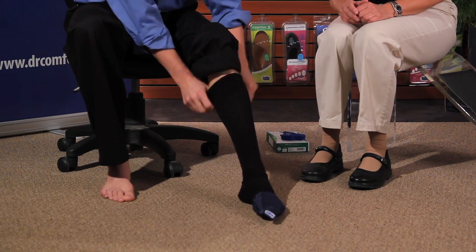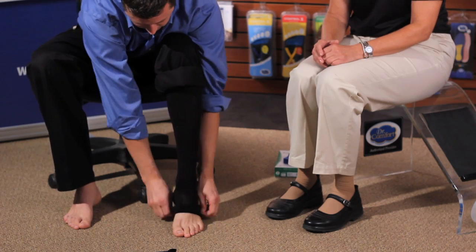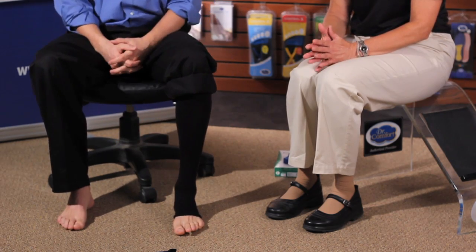It may need a little readjusting — that's normal. Then pull the toe slip out. With this, you can wear another stocking over it, wear sandals, and it's a little cooler. Or if someone has large feet, sensitive toes, hammer toes, or bunions, this might be the perfect option for them.